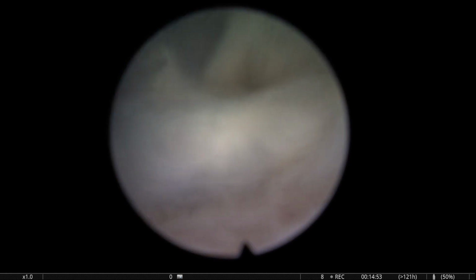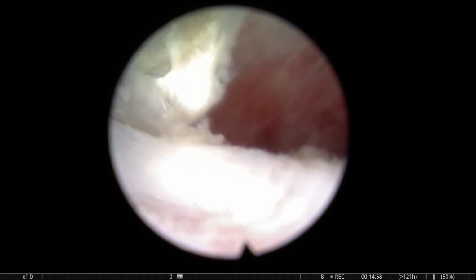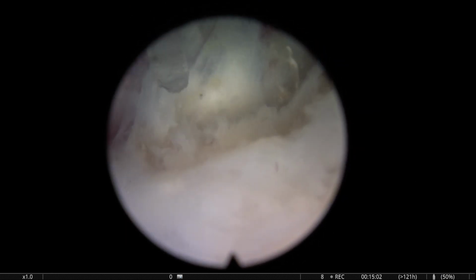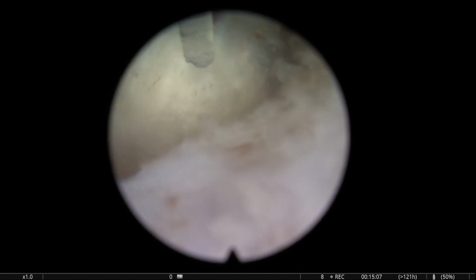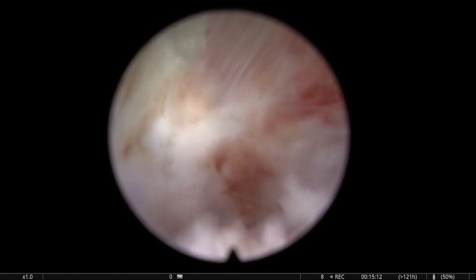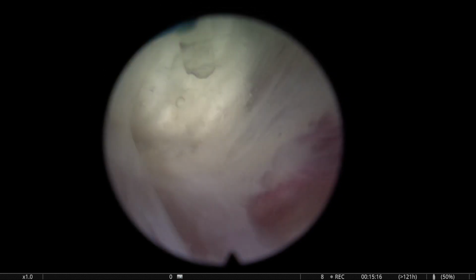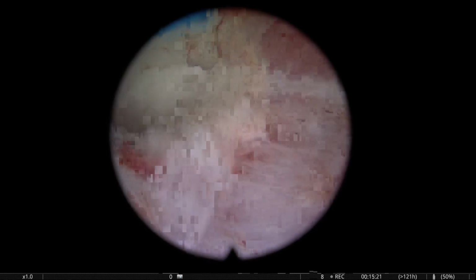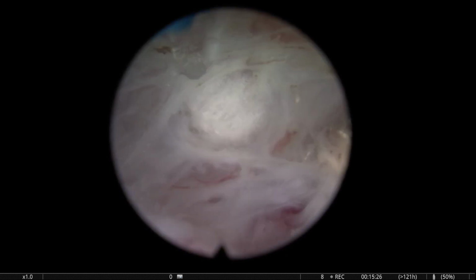And of course, often we're going to penetrate a little bit in the capsule, and we're going to see small perforations. And I usually say that small perforations are allowed, in the sense that sometimes in difficult cases like this they're inevitable, but we don't want to make them big. Okay, so we use the energy carefully to prevent doing big perforations. If we start to see that we're coming out of the capsule, then we have to correct before it's, let's say, too bad or too late.